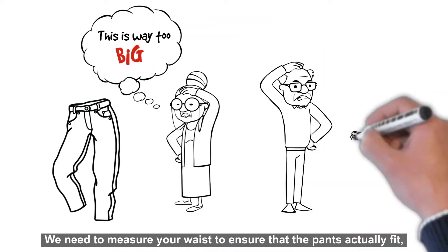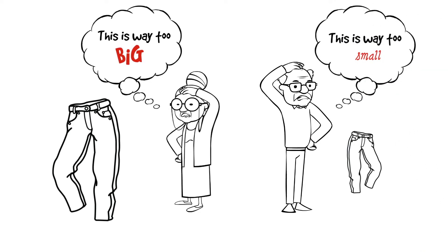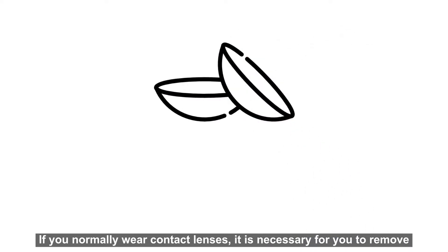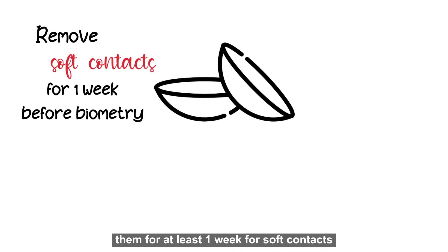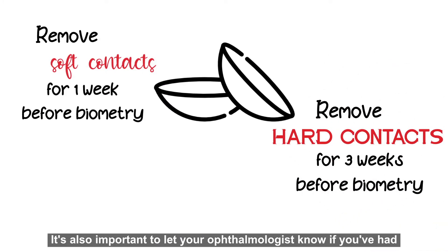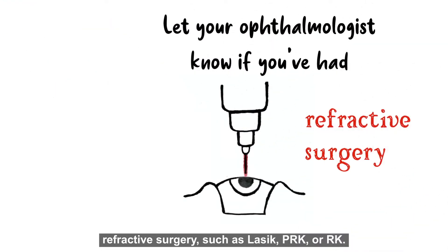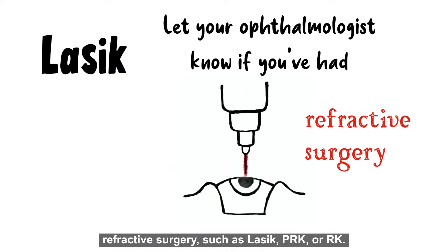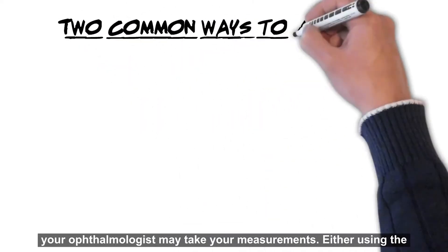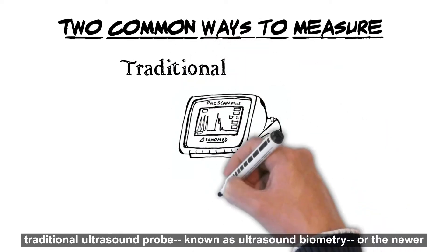If you normally wear contact lenses, it is necessary for you to remove them for at least one week for soft contacts, and at least three weeks for hard contacts. It's also important to let your ophthalmologist know if you have had refractive surgery such as LASIK, PRK, or RK. There are two common ways your ophthalmologist may take your measurements: either using the traditional ultrasound probe, known as ultrasound biometry, or the newer infrared laser, known as optical biometry.